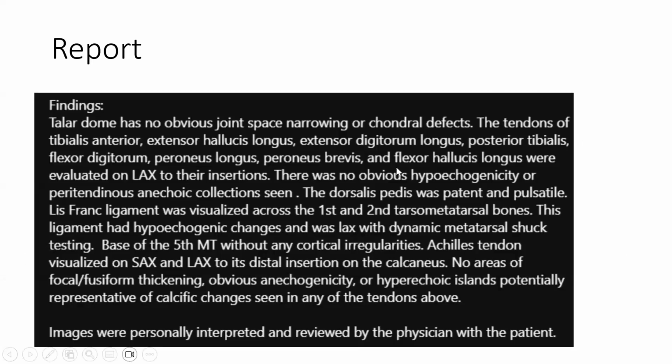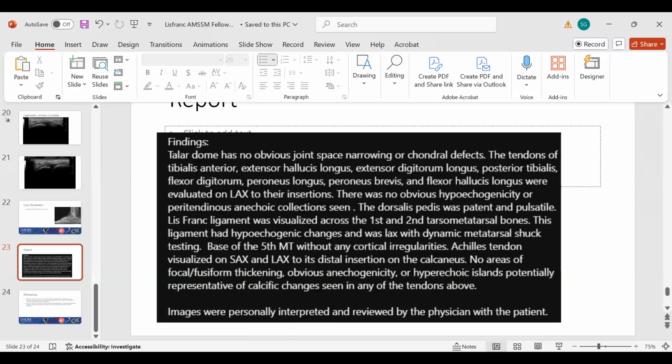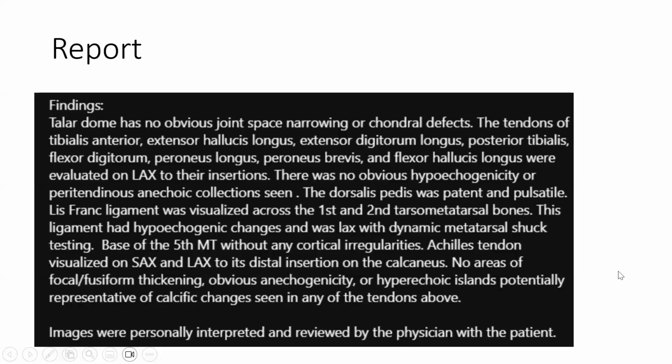As far as the protocol goes for this area, it's tough. There's nothing really standardized. So that's where these presentations are really helpful. Usually these are fairly high trauma, and so you can include a lot of the structures, as you had mentioned, taking a look at other ankle ligamentous injuries. I think when you're focusing on the midfoot area, the main thing is assessing those midfoot joints as well as the tarsometatarsal joints. Some of the important ligaments in the area that you had mentioned are going to be the talonavicular. You can also be looking at the bifurcate ligament, dorsocalcaneocuboid ligaments.